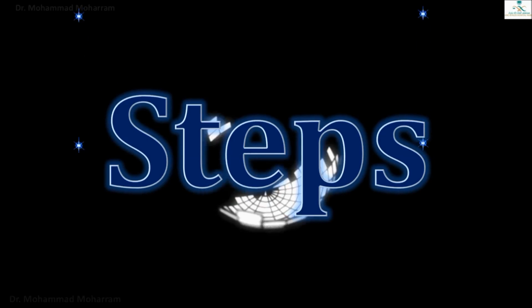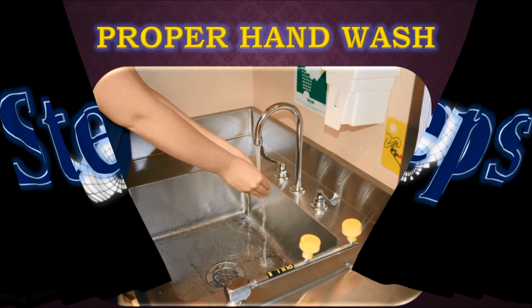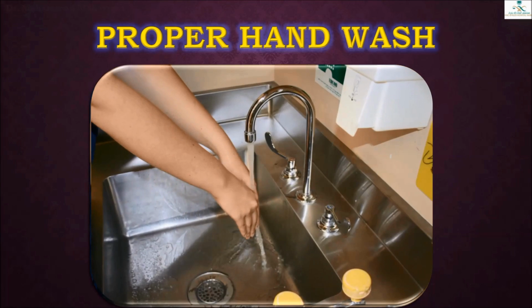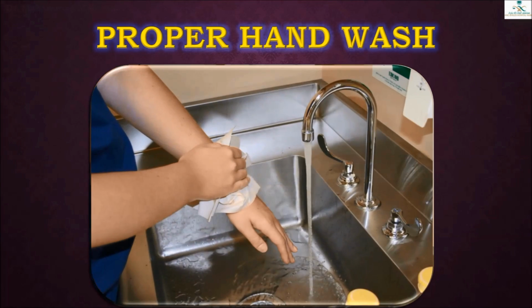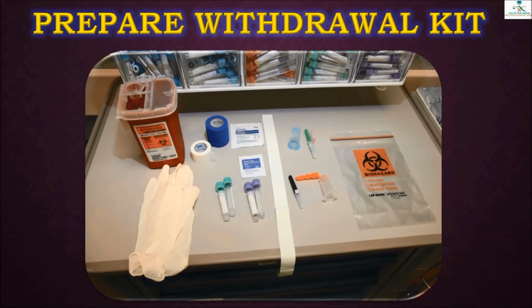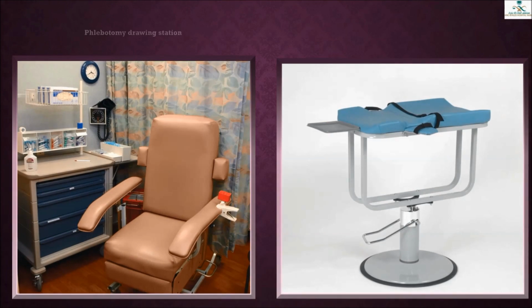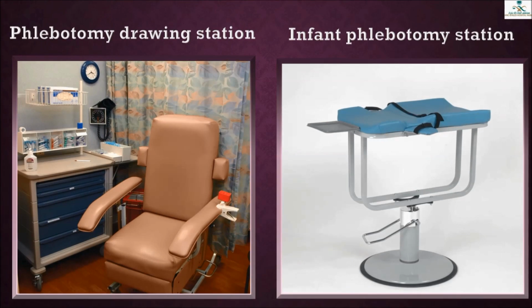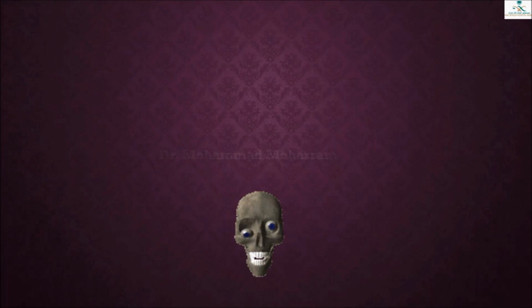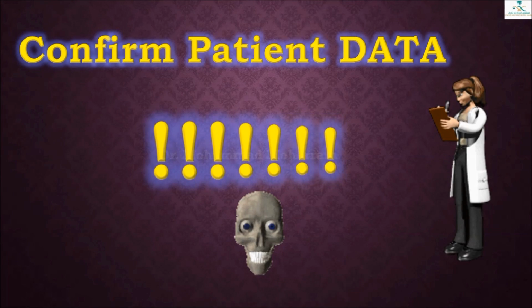Steps for sample collection. Do hand wash as recommended by the Infection Control Department. Prepare the withdrawal kit. Put the patient in proper position in the phlebotomy station unless the patient is bedridden. Wear gloves. Confirm patient data.